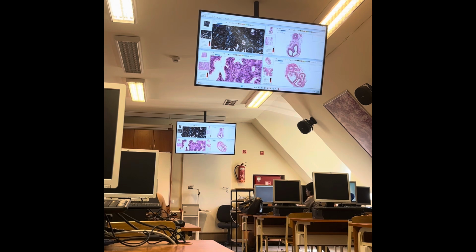Yes, yes. So if you look at, trying to catch a frontal view field, good examples for the two cells we can see. So basically the nucleus is what we can see, and they differ obviously. We sometimes see the entire extent of the smooth muscle cells, but sometimes not.